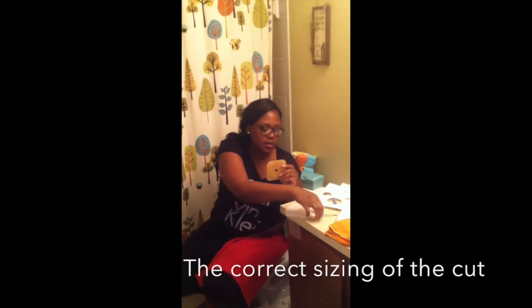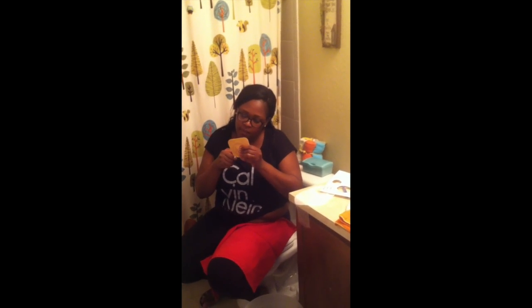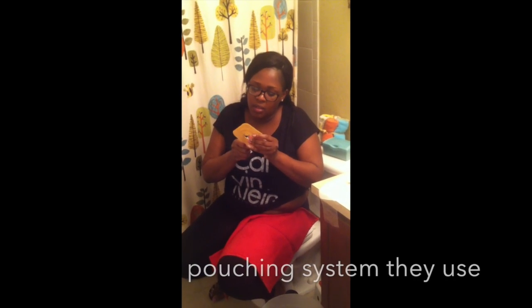So the sizing prevents leakage, is that correct? Yes. And you said you replace the adhesive at least once a day? Yeah, either in the morning or at night. Basically once you start doing it, you'll develop your routine and you'll know which time of day is better for you to do the actual stoma care.